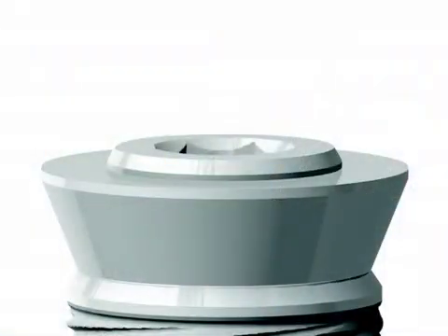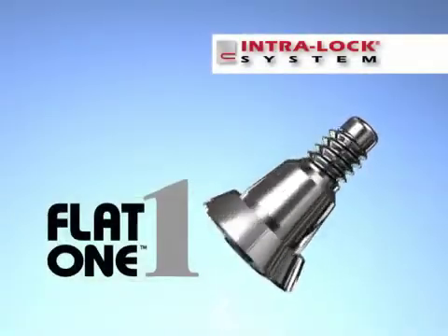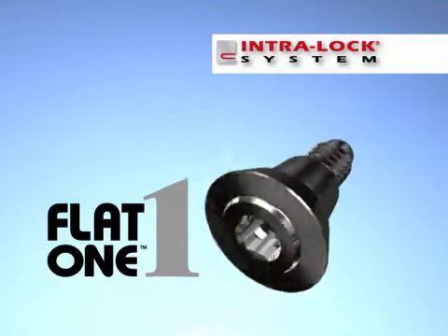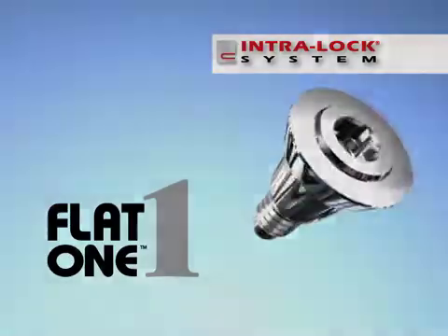Flat-1 abutments are characterized by having a flat occlusal table. The flat surface mates precisely with Flat-1 casting cylinders. This ensures that the load of the restoration is supported by a wide flat platform, in contrast to conventional two-piece abutments that rely on a retaining screw for support.